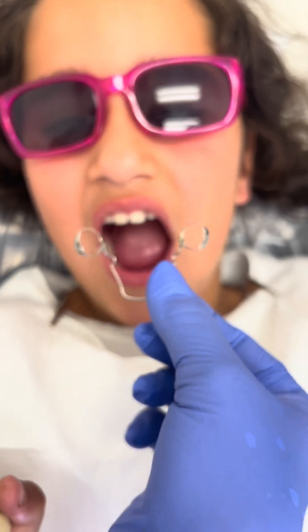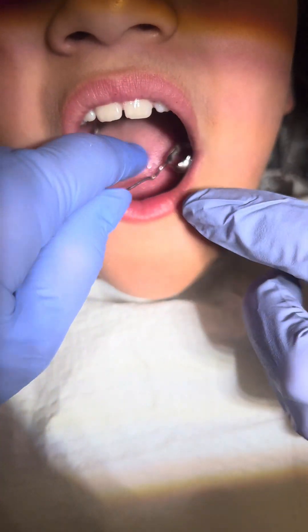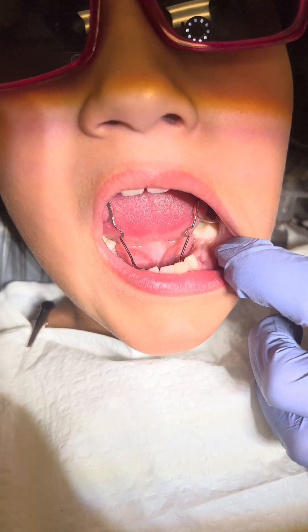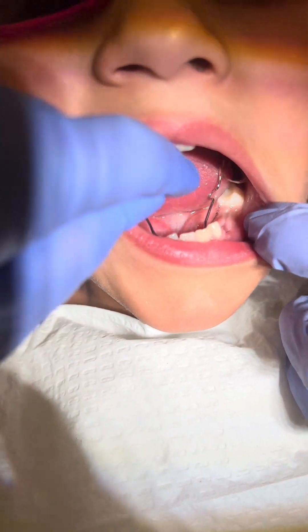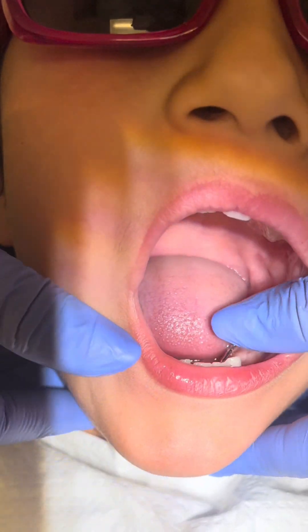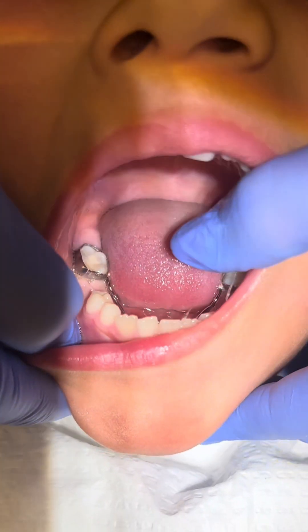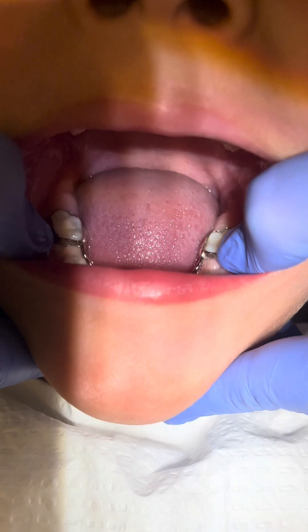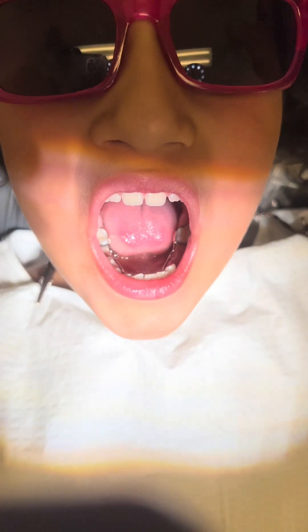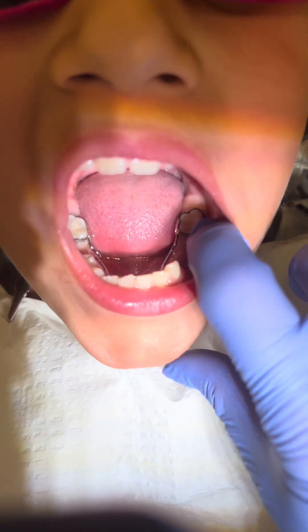Lateral space maintainer — lower lingual arch holding arch. This appliance is for the mandible. It reserves space when teeth are prematurely lost on the lower right or lower left, and is also used when two teeth are missing next to each other. This appliance also prevents the back molars from drifting forward.